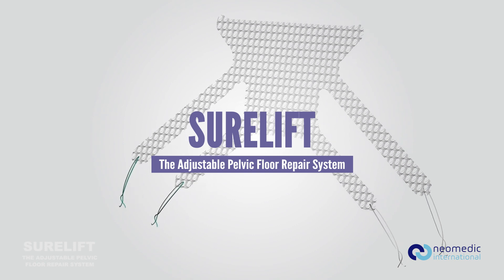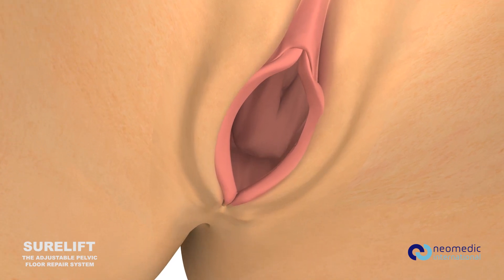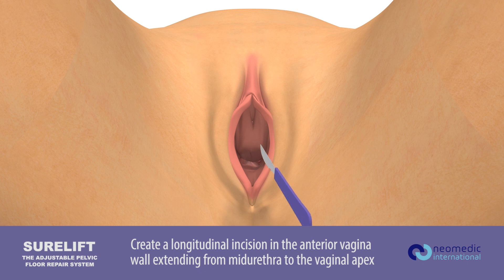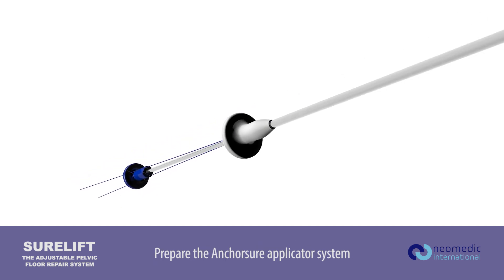SureLift Surgical Technique. Create a longitudinal incision in the anterior vaginal wall extending from mid-urethra to the vaginal apex. Prepare the AnchorSure applicator system.